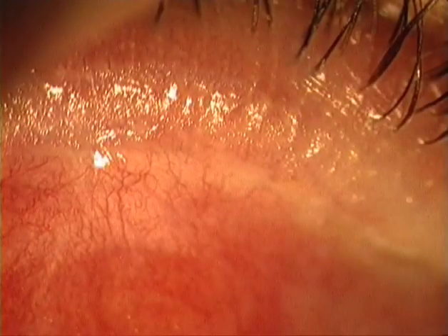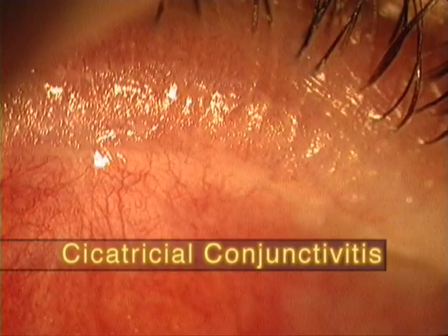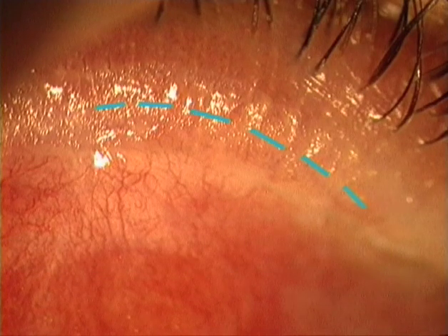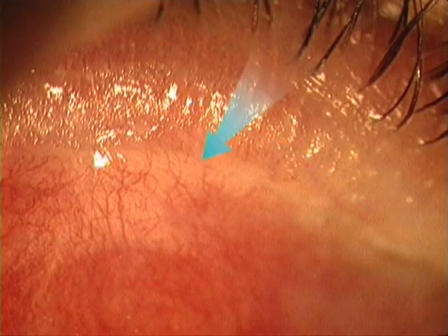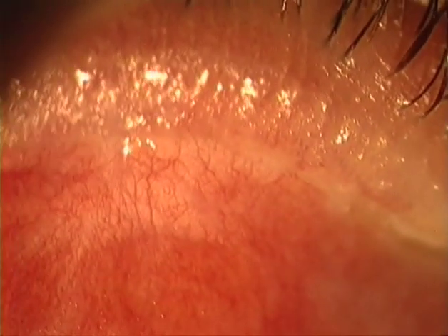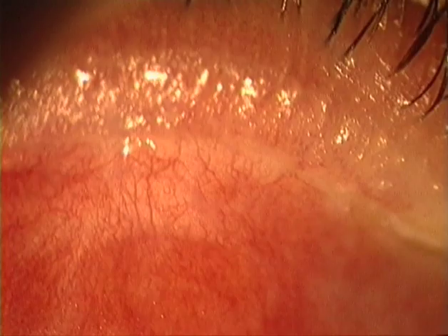In this case of cicatricial conjunctivitis, the cutaneous epithelium has been drawn over the edge and now extends towards the inner side of the lid, so that the dry reflex also appears on the inner side of the lid. Here we see even a wide band of macerated keratinized epithelium, which desquamates into the lacrimal film and so becomes a source of chronic irritation.